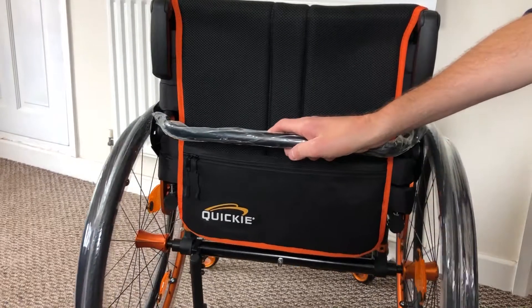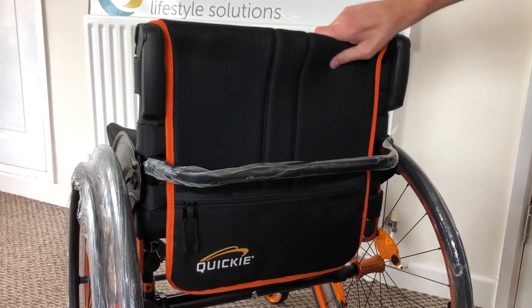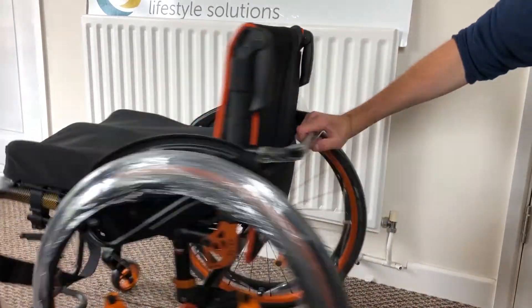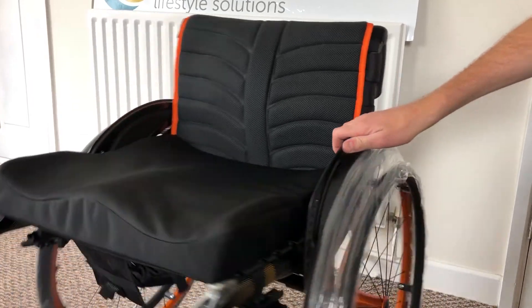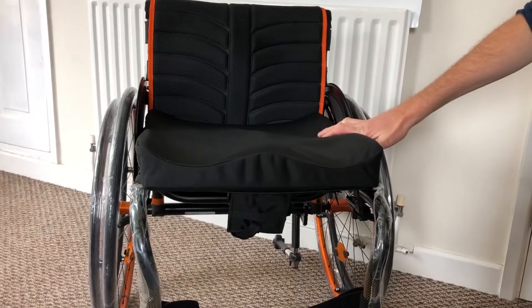The backrest itself is Exo Pro — it's got a spongy, breathable material that's very comfortable when you're sitting in the chair. The binding is orange which matches completely with the chair along with the caster wheels.